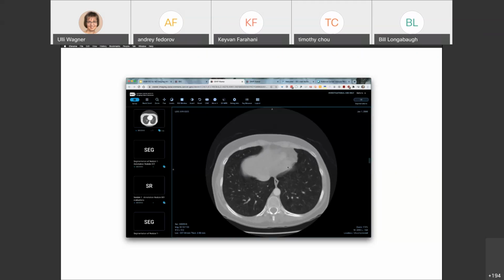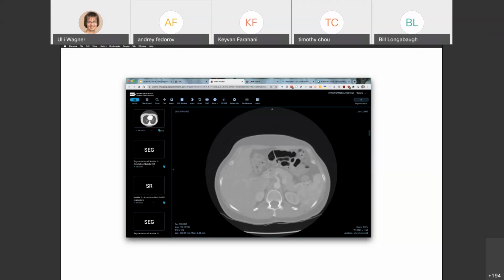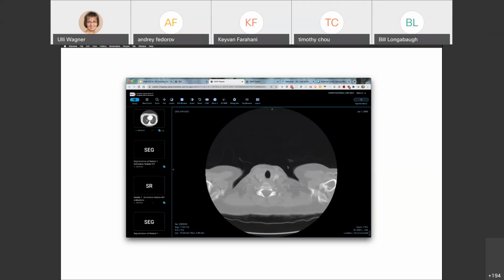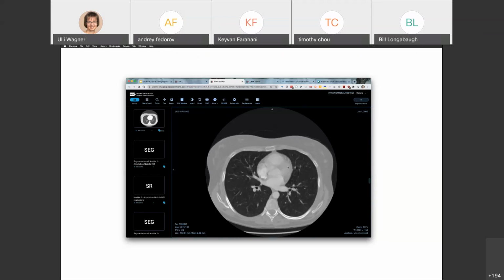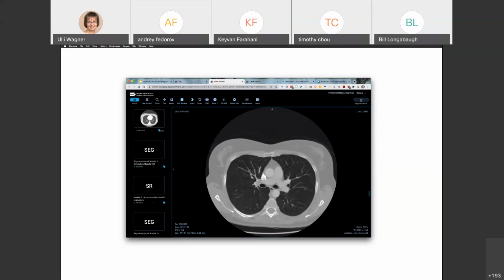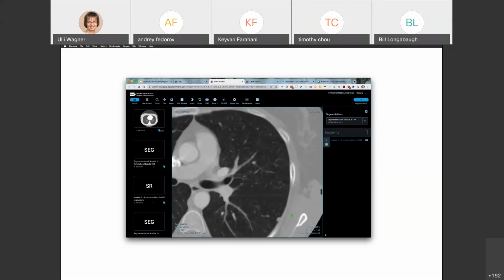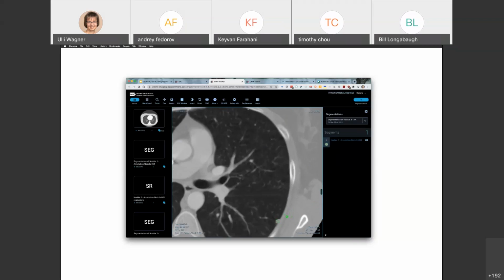Because of that, initially you will experience hiccups scrolling through the study, but once the complete study is downloaded, it should be very smooth. And as I show here, you can see both the images and also the annotations for this image in the interface.